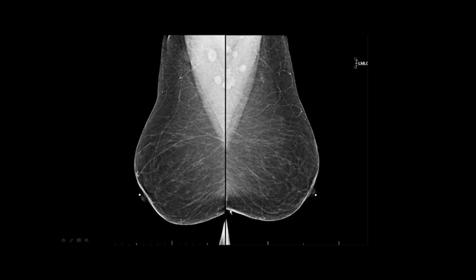Try if you really want to use this patient, or if you're limited to patients. I know some facilities don't do a whole bunch of patients daily, so it's hard to get accreditation images within the time that they allot you. So if you want to try and use this patient, bring the patient back.